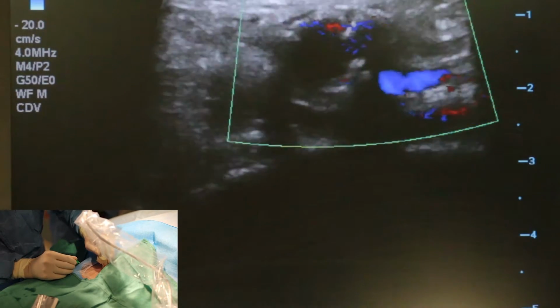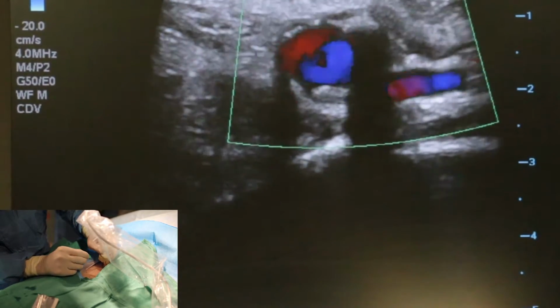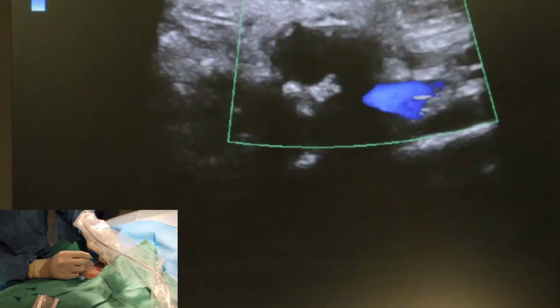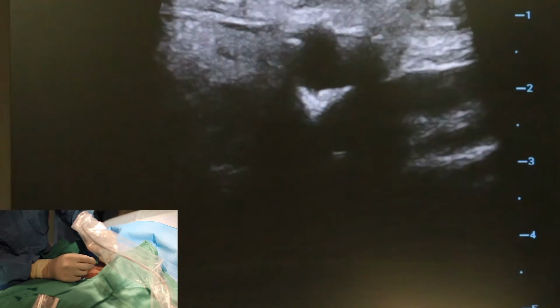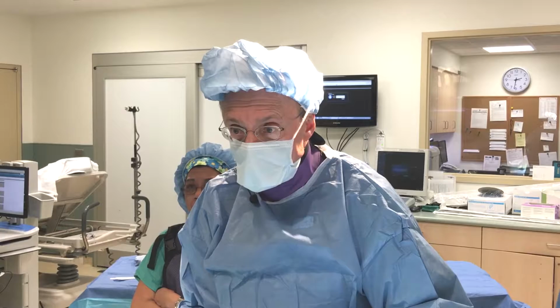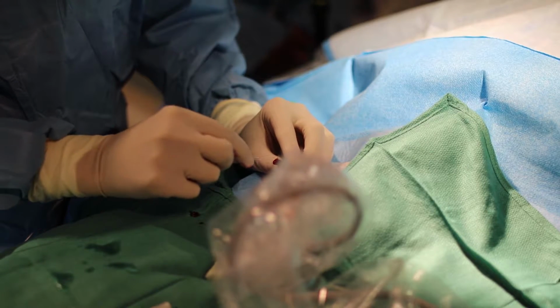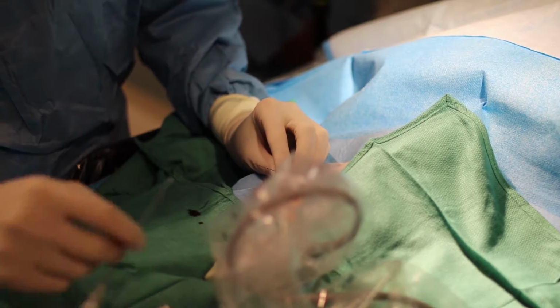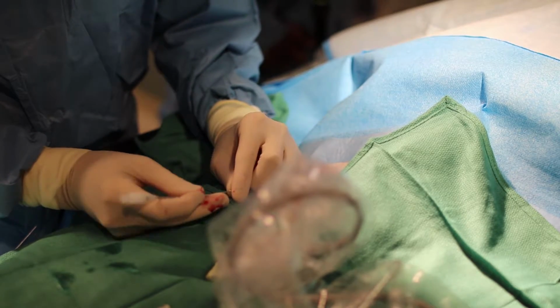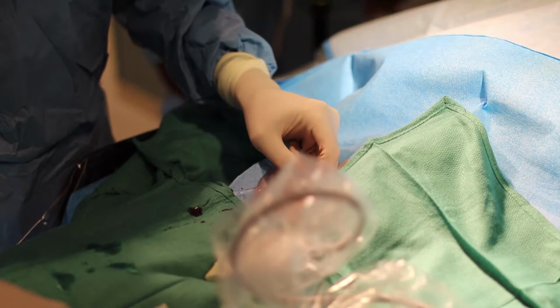Then I'm going to center the probe right over the artery, and take my regular micropuncture needle, slide it just behind the probe, and as you see, it'll come down and it actually slid right into the artery. Sometimes it's more obvious because you can see the artery dimpling. So a single wall stick, perfectly placed, which I do think will reduce the likelihood of a bleeding complication when the sheaths are taken out.